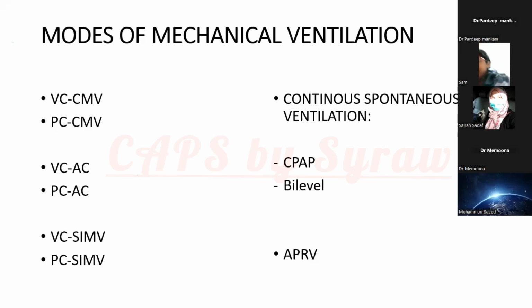Also, there is this concept: in the beginning of the era, there was the concept that the ventilator is the master, and the patient has to behave accordingly. But now the current practice is that the patient is the master, and we have to make the ventilator work according to the patient's neural respiratory drive. So these are the points we have to keep in mind.